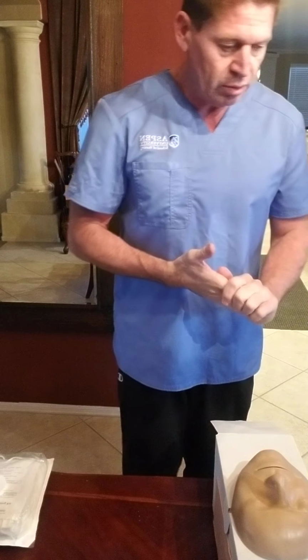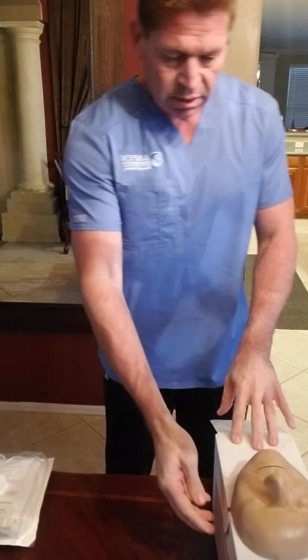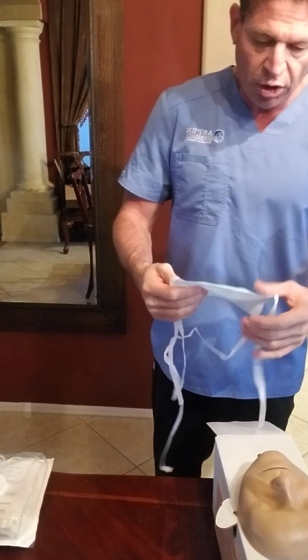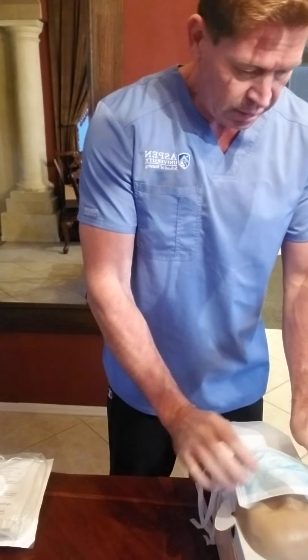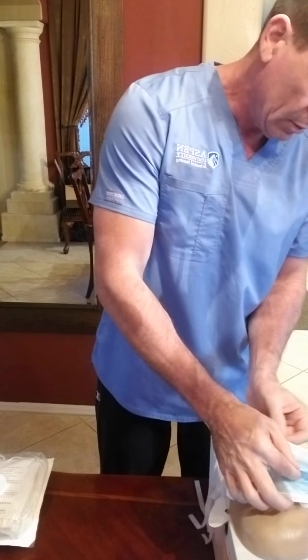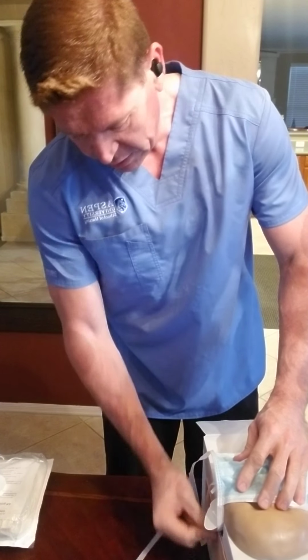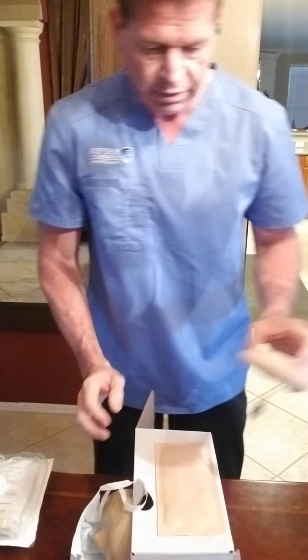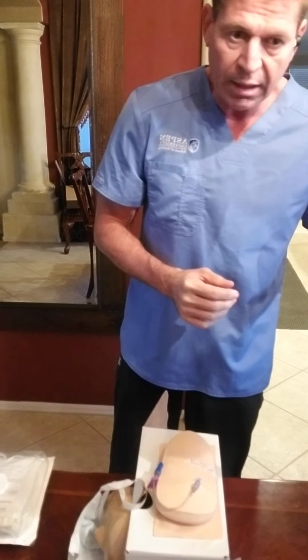One of the things I'm gonna need you to do is wear a mask, and then I'm gonna have you turn away from the incision. So I'm going to go ahead and put this mask on. This mask is on the patient now. And then I'm going to turn the patient away from the incision, from where the central line is located. I'm just pretending that's my central line because we don't have an actual central line.